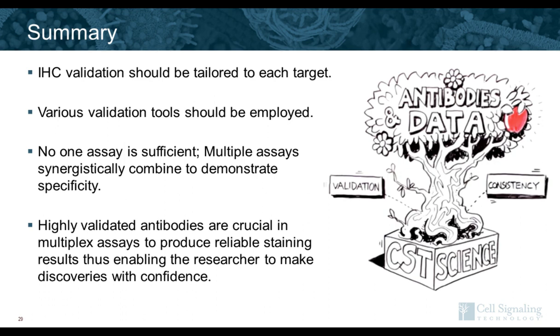Thank you, Chris. Bill, are your multiplex kits limited to 7 targets? You mentioned using 9 OPALs. How was the spectral unmixing? That's a good question. In my presentation, I talked about doing 6 biomarkers plus DAPI. Recently, a little over a year ago, we came out with 2 new OPAL dyes, so that allows us to do 8 biomarkers plus DAPI. On the Vectra Polaris, there are 2 options. You can do whole slide 7-color staining, and then you can also do field of view 9-color staining.